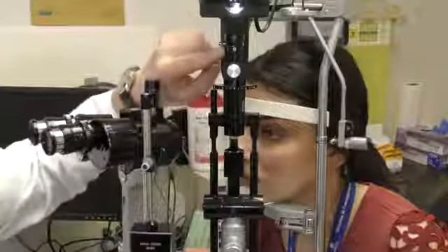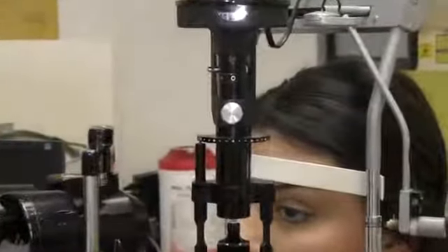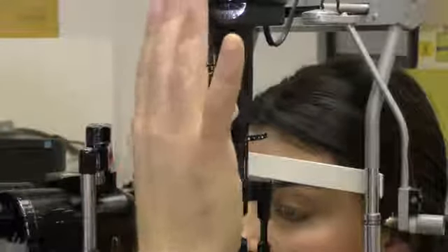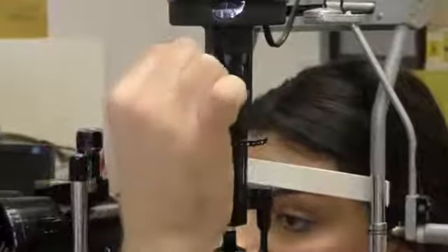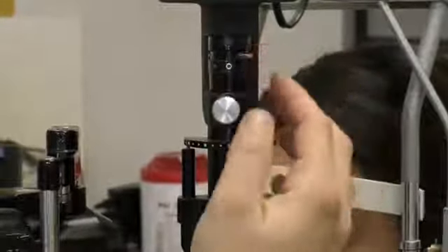Next thing I'm going to show you here, okay, is there's 3 or 4 different filters here, okay? And what these do is they allow you to change the light intensity, okay? So you can change it, and when it's all the way to the end, on this machine in particular, it's at the brightest light intensity. If you move it towards the middle, it goes to a lower light intensity, which we use for our fundoscopic exam. And if you move it all the way to the side, you can get different filters.